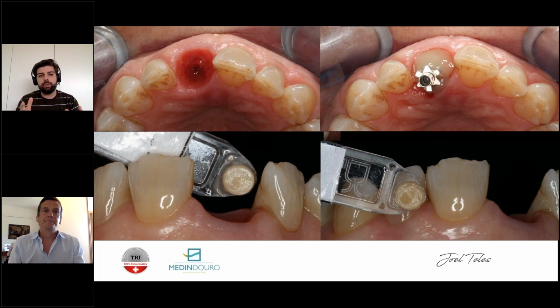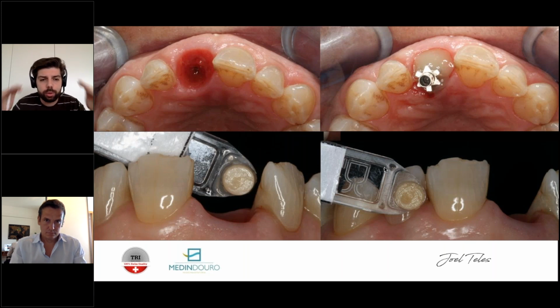And because every camera has its own identity, there are different approaches regarding colors, with different cameras and different setups. Then the monitor of your computer also has a different approach to color. So this takes a while to be completely synchronized between the lab and you. But after you pass this point, it's very easy to do.